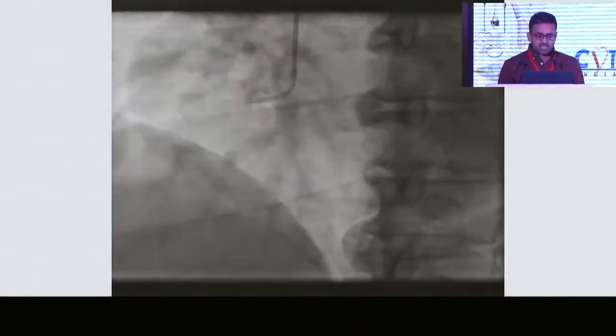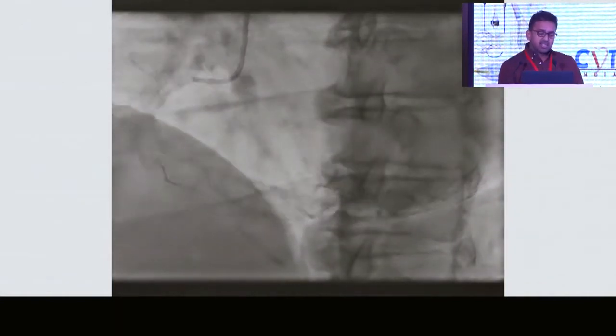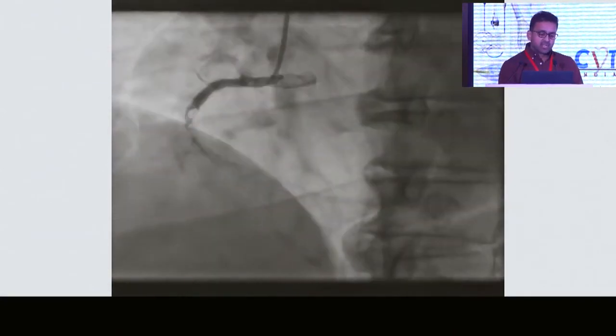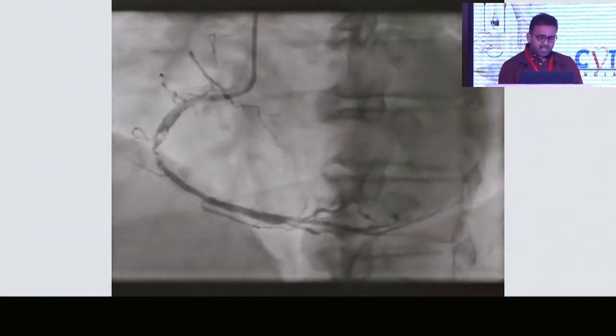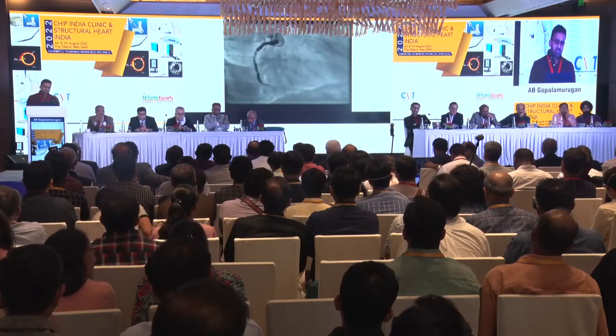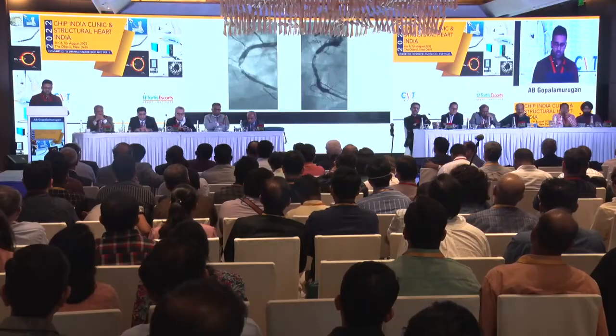So this is a patient who had critical ischemia, angina class 3 to 4, very tight right coronary artery. And it's been having it for some time, so you know it's not thrombus, it's going to be something hard and calcium. This is another view. You can see here on the RAO, it probably is interrupted at one point, but you couldn't be sure. So this is just a close-up of the LAO and the RAO, a long segment, fairly complicated lesion.